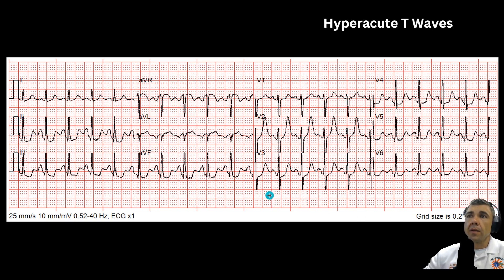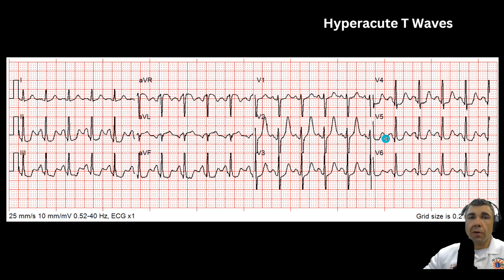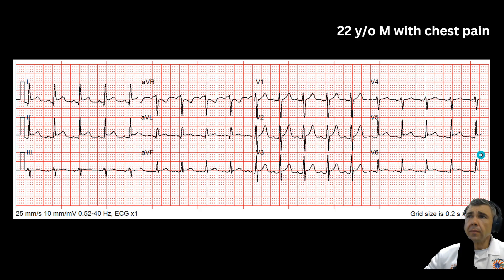Here's another example of hyperacute T-waves. These are a little bit narrower, so they almost look like hyperkalemic T-waves, but coupled with that ST depression, these are actually called DeWinter's T-waves. DeWinter's T-waves are J-point depression with hyperacute T-waves, especially in the anterior leads V2 and V3 — the anteroseptal leads. They are a STEMI equivalent, really, indicating the patient is going to have a significant MI if they're not already having it.